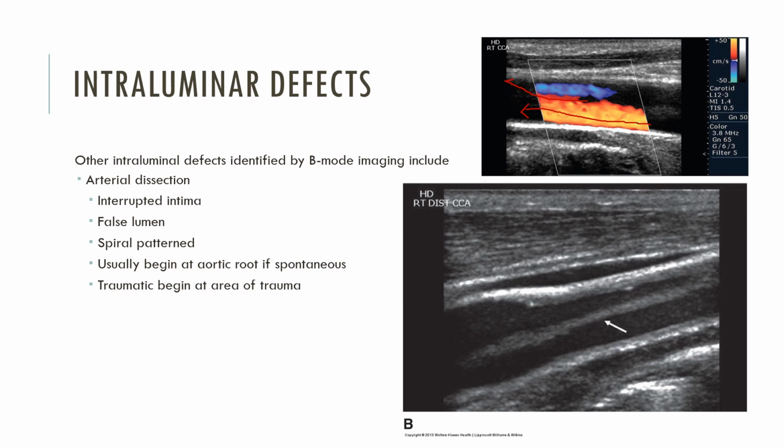Now, over time, with that pressure coming off the heart, pumping blood into this end, it can continue to tear that intima away from the media farther and farther till you can dissect all the way up to the brain. Or you have such a significant dissection that all of your blood is going into the false lumen, none is in the true lumen, and you're suffering severe lack of perfusion in the brain. So our arterial dissections are very traumatic. They're very serious. This would be an emergent condition that I'd immediately let the radiologist know about.